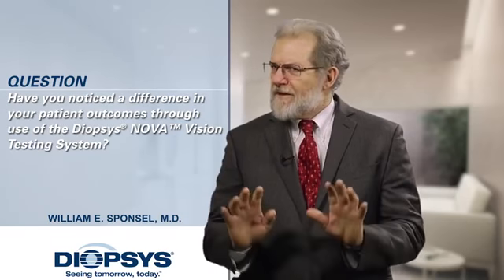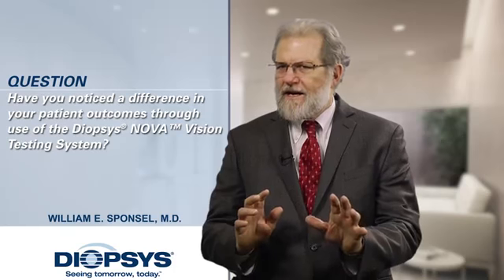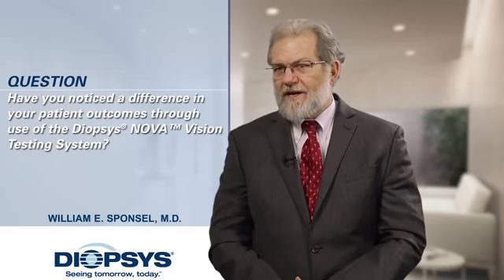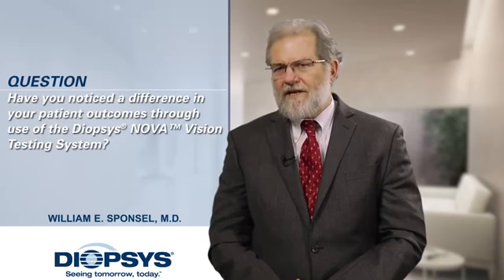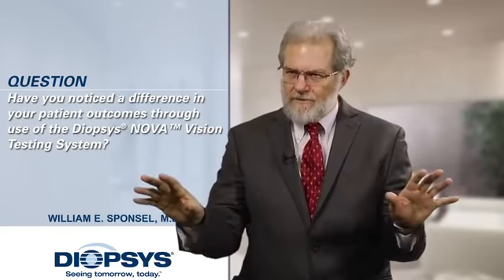The holy grail for glaucoma, and for all forms of progressive optic neuropathy, is to be able to nail down whether the problem is in the retina or in the visual pathway behind the eye. And now there's a way of finding this out that we didn't really have before. It has helped us tremendously because we find that there are patients in the conglomerate of presumed glaucoma coming in, and some of them have a predominantly retinal problem that shows up on the electroretinogram. Some of them have a predominantly visual pathway problem that shows up on the visual evoked potential. Some have both. Now we can segregate our patients into subgroups.